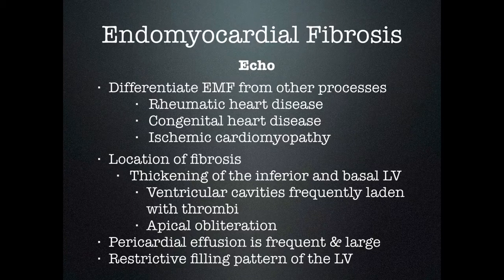Pericardial effusions can be present and are often large, and they may lead to tamponade. You will also see a restrictive filling pattern of the LV if you look at the mitral inflow or the aortic outflow.